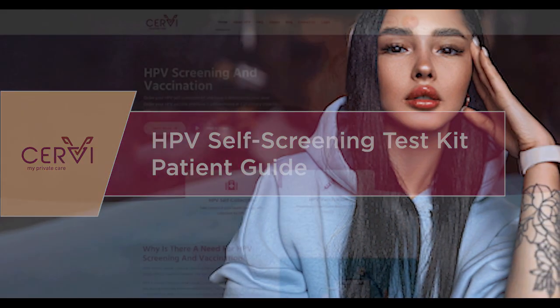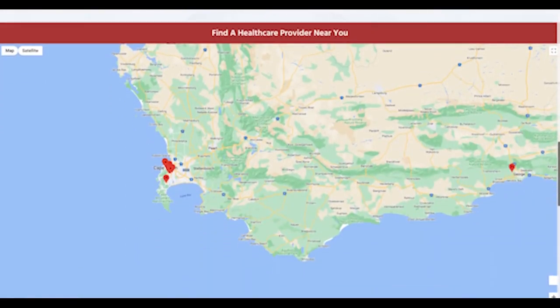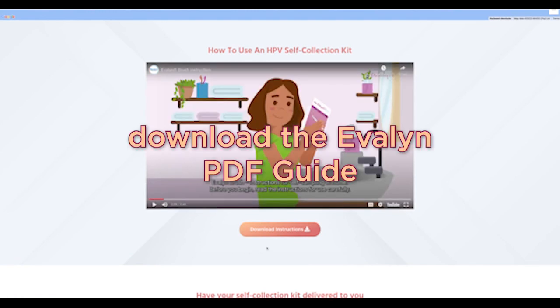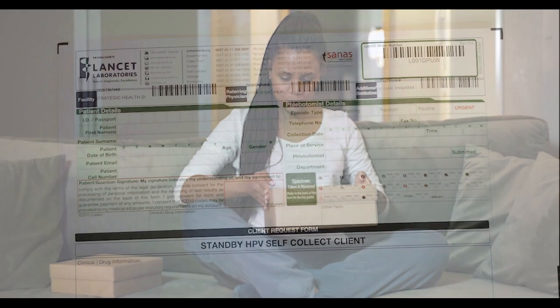Before you begin, visit the Cervi website and take a moment to watch the video on how to use the Evalyn HPV self-swab test. You can also download the Evalyn PDF guide. Now that you've watched the video, let's get started.